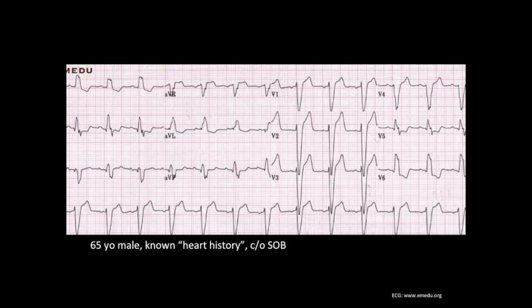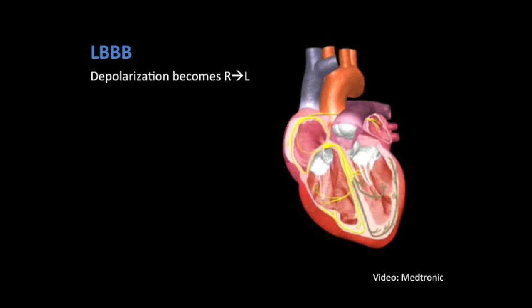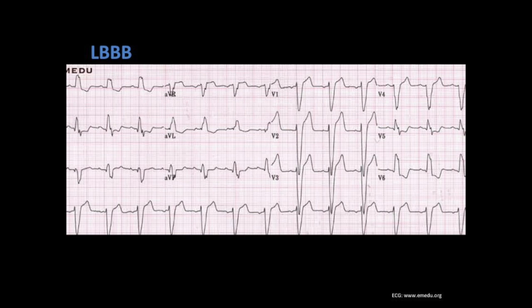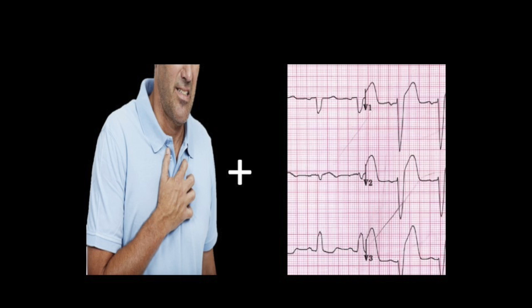This first case is a 65-year-old male with known heart history complaining of shortness of breath. This ECG shows some classic findings of a left bundle branch block. In a left bundle branch block we get a blockage of the left side of the conduction of the heart. Because of that, the normal depolarization that goes from left to right switches to right to left. Because of this, we get ECG findings including a widened QRS, broad notched R wave in leads I, V5, and V6, and a dominant S wave in V1. In addition, the ST segment and T wave are opposite the vector of the QRS. So now we have this really funky looking baseline ECG which could possibly mask signs of a STEMI — so what do we do when this person presents with active chest pain?